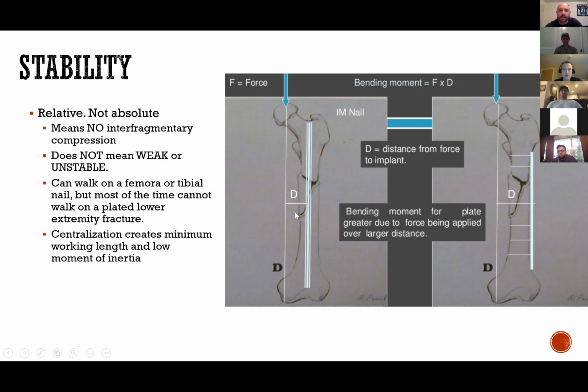Whereas this type of fracture may be amenable to compression and getting that type of healing, you don't need that with a nail. You can just go for a secondary intention, and by restoring the relationship of the femoral head and the alignment of the neck to the femoral condyles and the rotation, whatever happens in the middle doesn't matter. It's going to heal like gangbusters. I think, Jeremy, is there anything you want to add to that? No, that was nice.